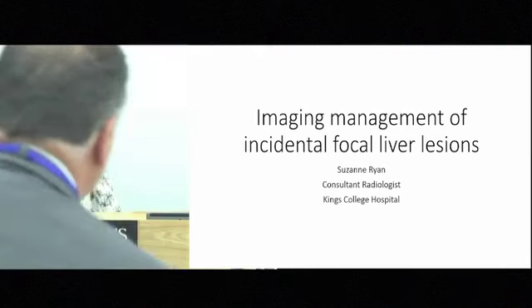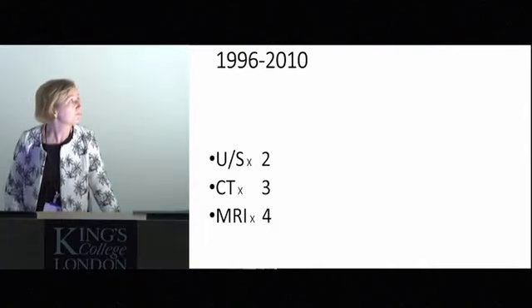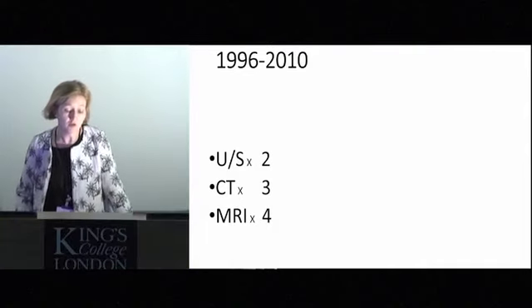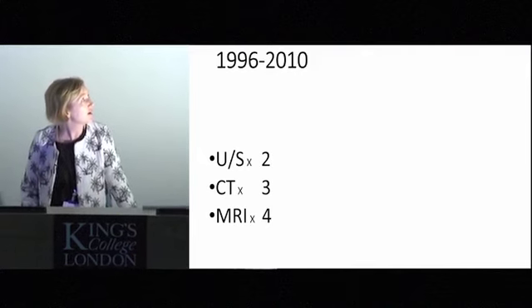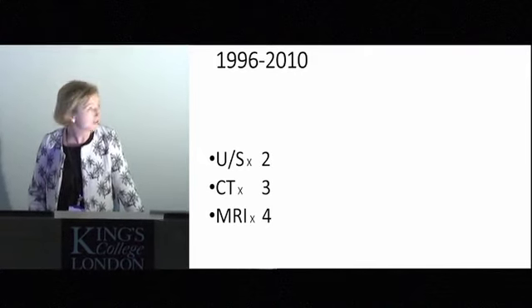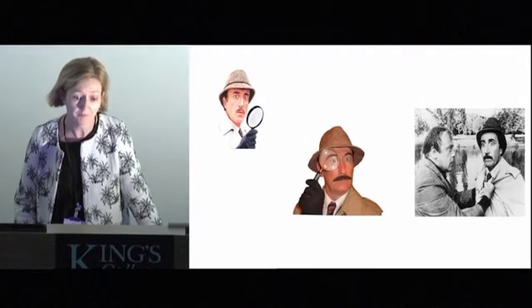I'm Suzanne Ryan, I'm a GI radiologist and I've been asked to talk about the imaging management of incidental focal liver lesions. And we're all aware that the number of examinations we do increases manifold every year, and therefore the number of liver lesions and incidental liver lesions that we pick up increases manifold per year.